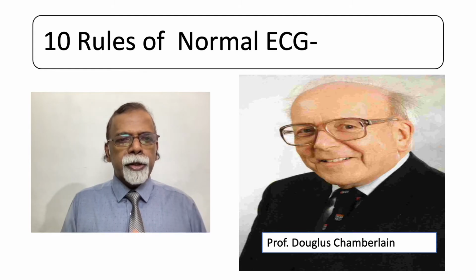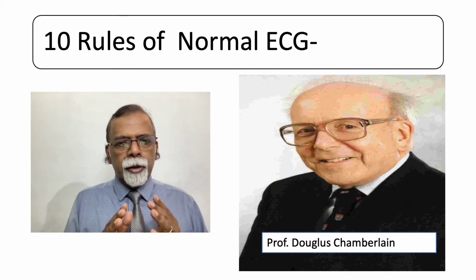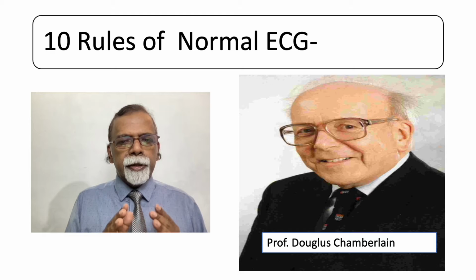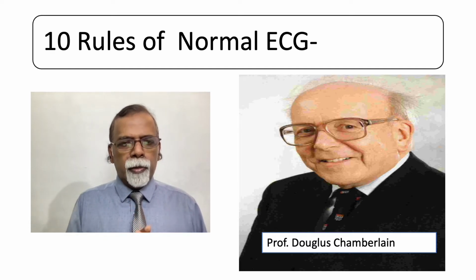Today we are going to discuss 10 rules of normal ECG. These were developed by Professor Douglas Chamberlain, the British cardiologist who introduced training of paramedics in ECG. These simple rules are used to identify whether an ECG is normal or abnormal.